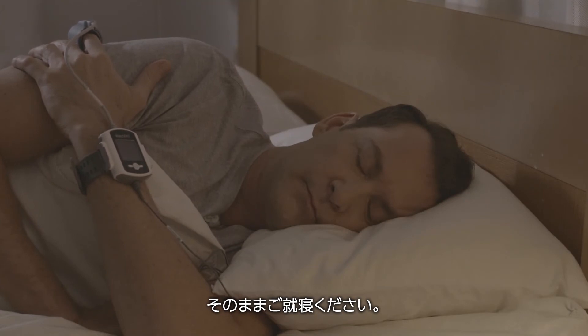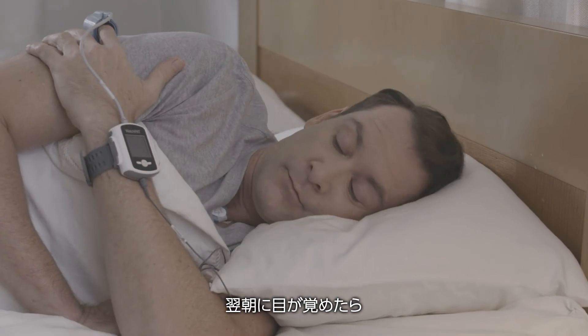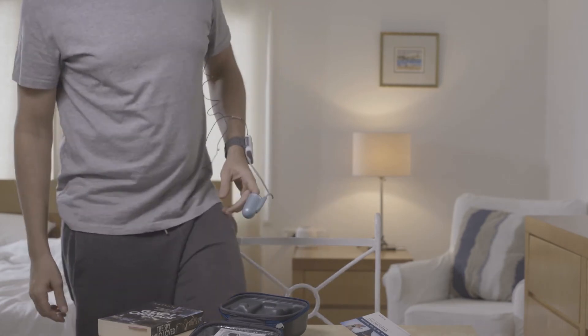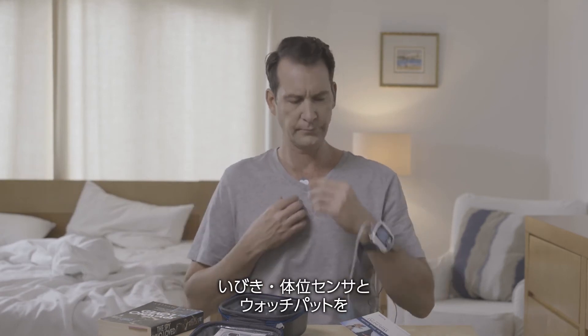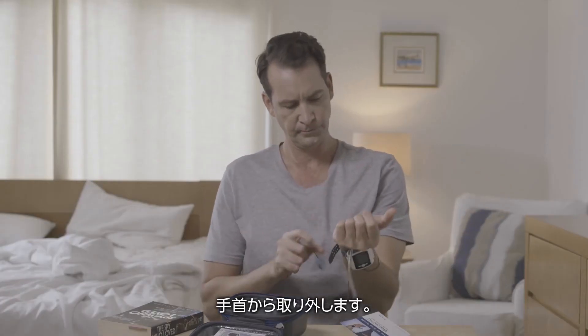Good night, and good morning! Remove the probe from your finger, remove the snoring and body position sensor, and remove the device from your wrist.